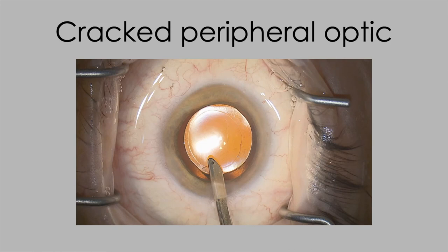One interesting feature in this case: there is a small crack visible when washing over with the Simcoe in the peripheral lens optic. Cracks in the optics are not uncommon during lens injection. Providing they're well out in the periphery as here, you don't need to do anything about it. If the crack is in the middle of the optic, the lens has to be exchanged — we'll show techniques for that in another video.